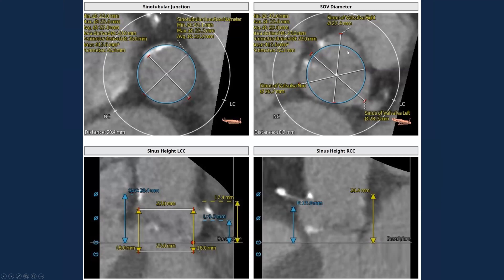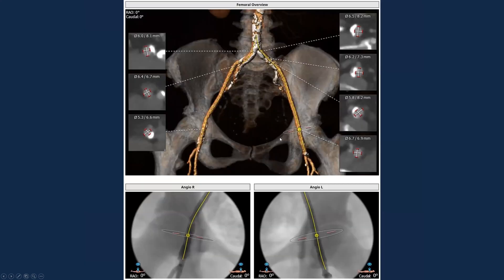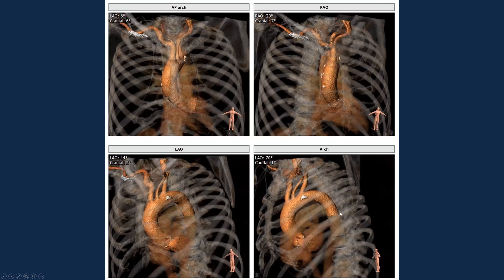You also want to look at the sinotubular junction and sinus of Valsalva dimensions. On the bottom left, look at the left main height and left sinus height in terms of risk of coronary obstruction, and potential tall and bulky left cusp. You can superimpose a virtual valve to see how it may position. In terms of access, look at where you want to puncture for femoral access — both major and minor — any calcification and severity along the iliofemoral artery. You can also look at aortic arch morphology and whether cerebral embolic protection may be feasible.